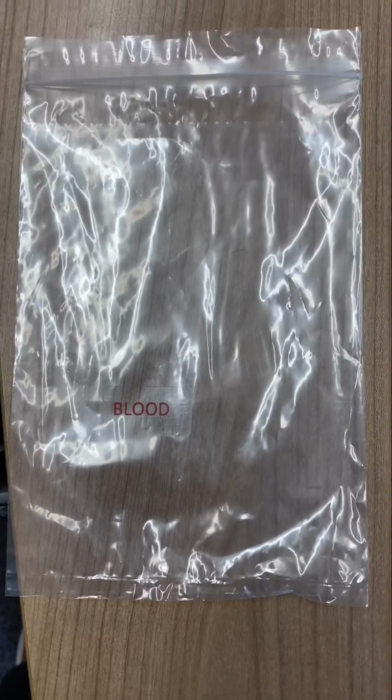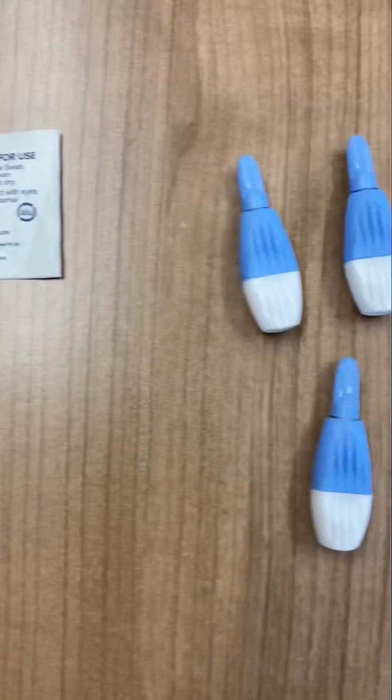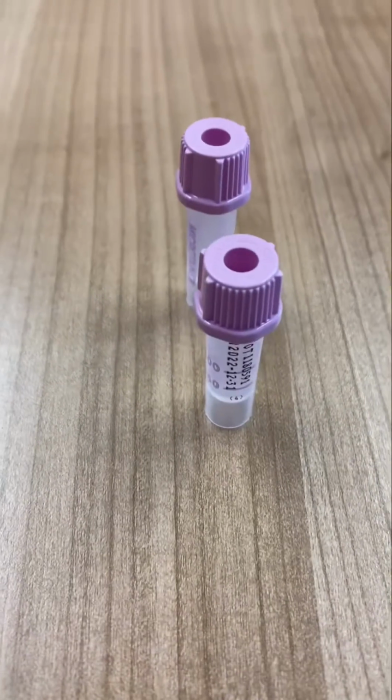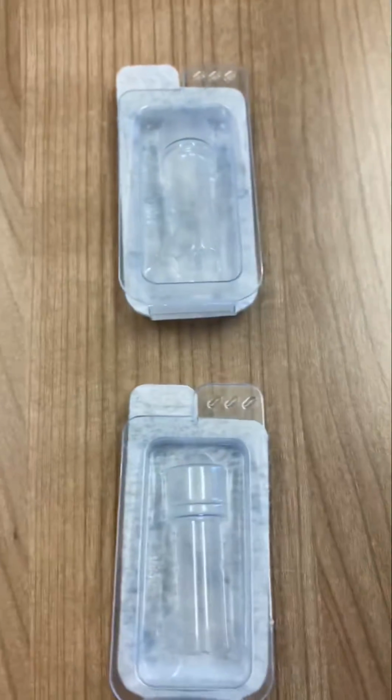In your blood collection kit you will find sterile wipes, 3 lancets, 2 sample collection tubes, 2 plasters and 2 protective cases.